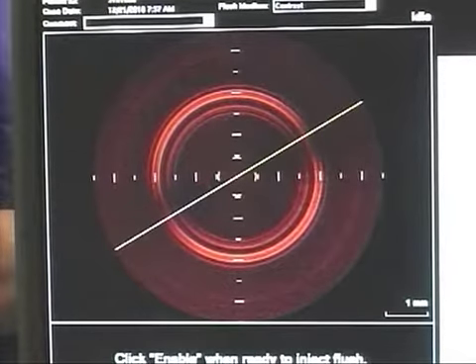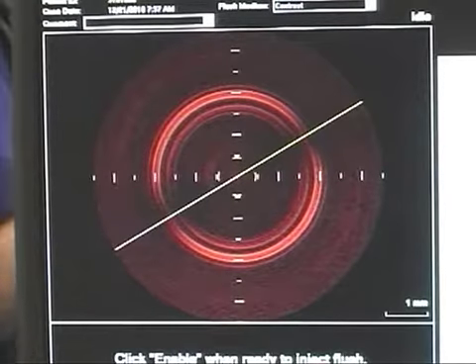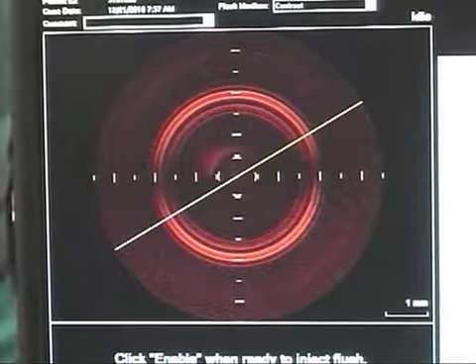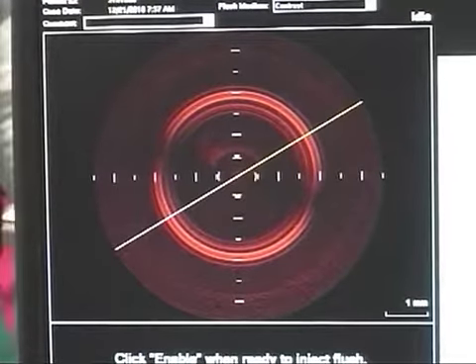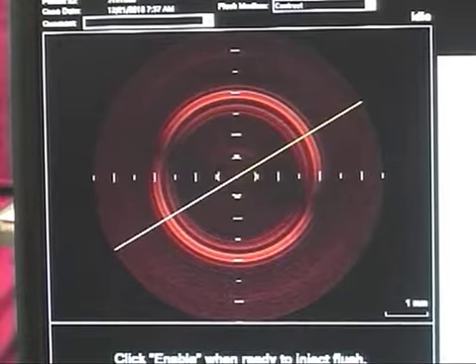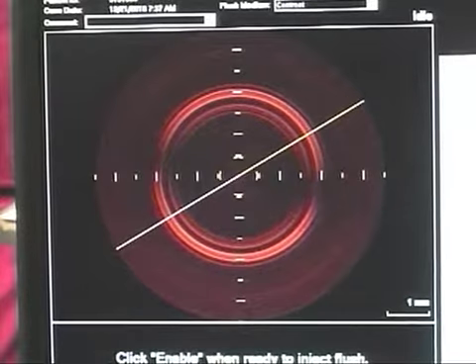Is this the right coronary artery? Yeah, we are actually doing the OCT of the OM where the stent was placed previously. This patient was done about a month ago. I just wanted to show if we are ready to show the live. Angiographically, the stent looks perfect. So let's see how the OCT and the additional information we get.